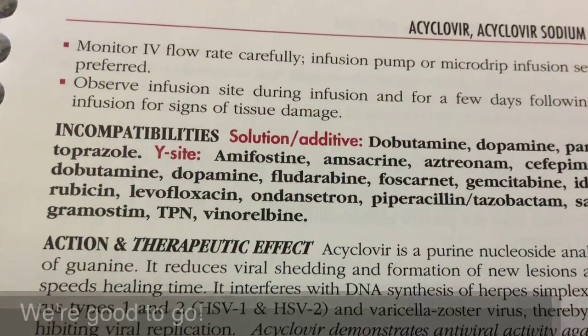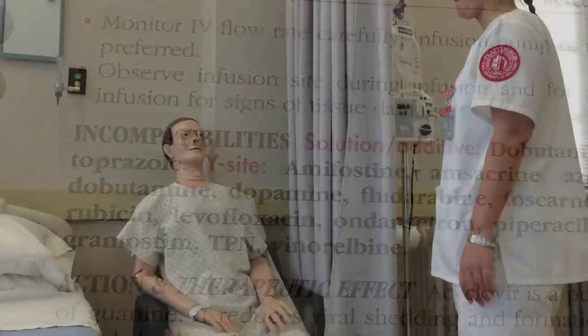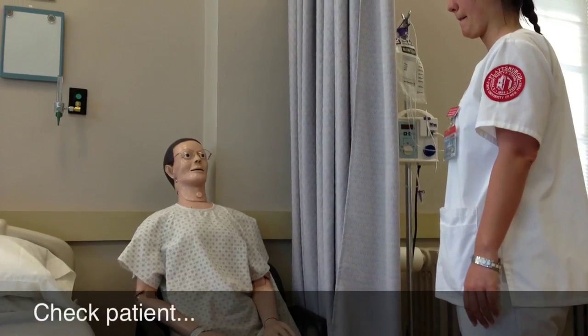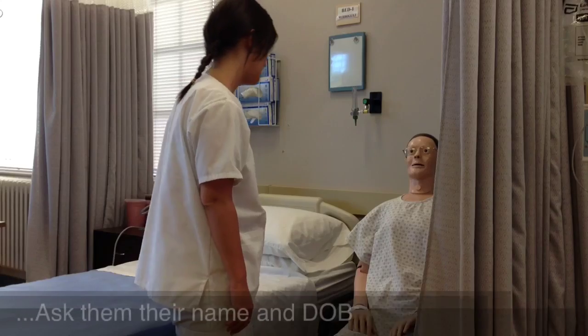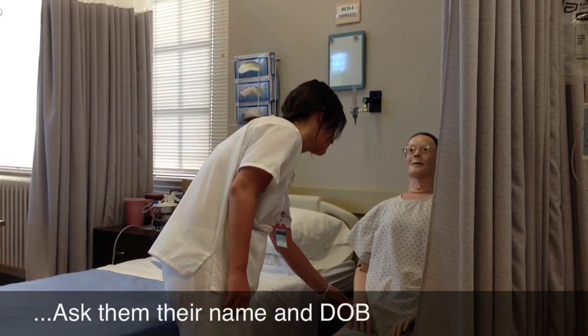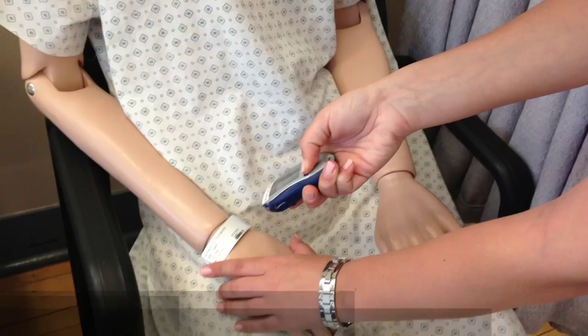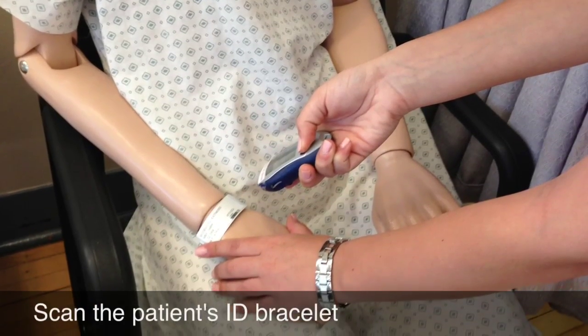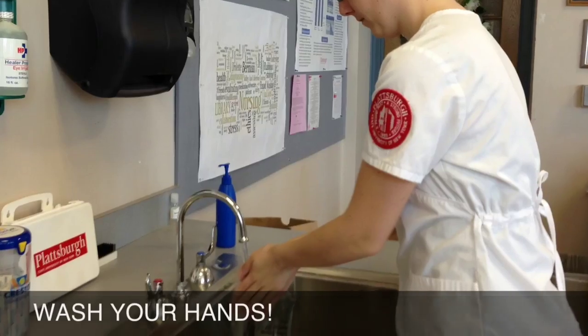Checking the compatibility of your medication and your IV fluids is very important. Using a drug book is very simple and easy — it'll tell you whether or not the two solutions are compatible together. Next, you're going to want to make sure that you're giving the correct medication to the correct patient. Make sure you ask them their name and their date of birth, which you can check against their medical record or their bracelet.